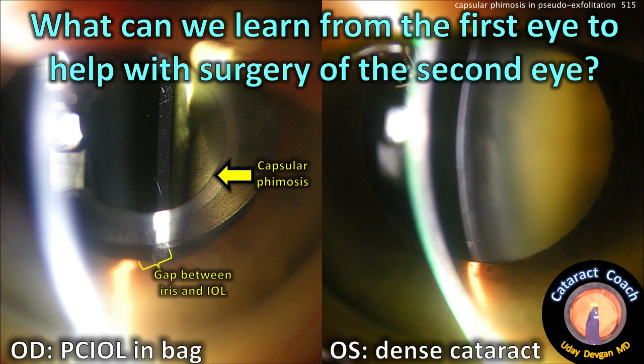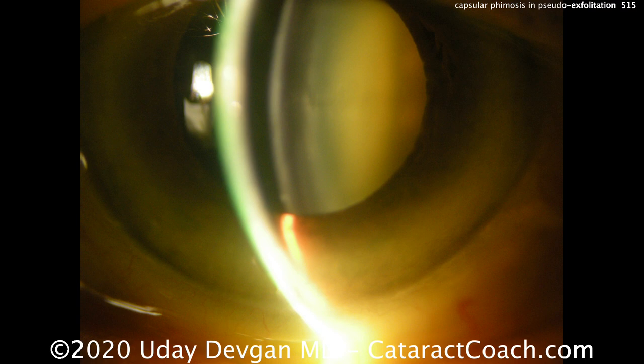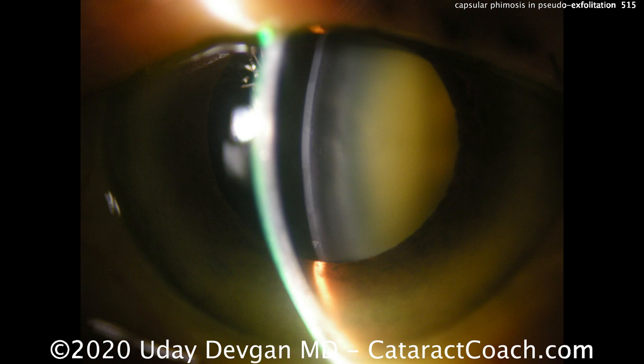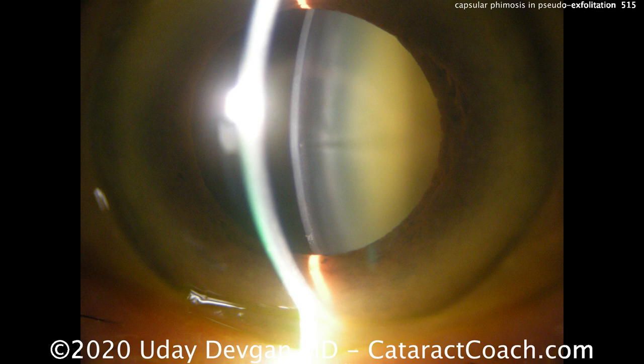What can we learn from the first eye to help with surgery of the second eye? Here's the eye of the cataract. You can see the anterior chamber is very shallow — the gap between the anterior lens capsule and the cornea is very narrow. This slit beam image shows the whole picture. Again, a very shallow anterior chamber, less than two millimeters in anterior chamber depth. The lens is very dense — at least a three to four plus nuclear cataract. It's not going to be a simple surgery.